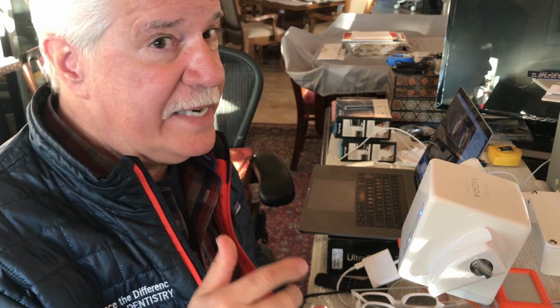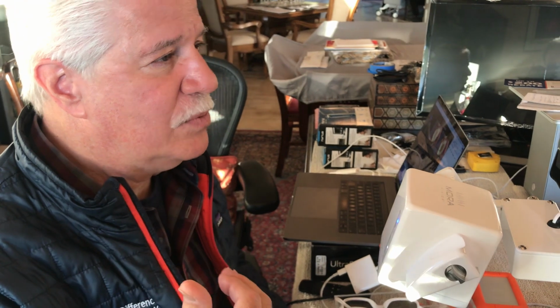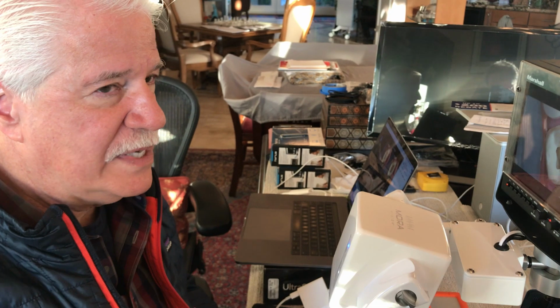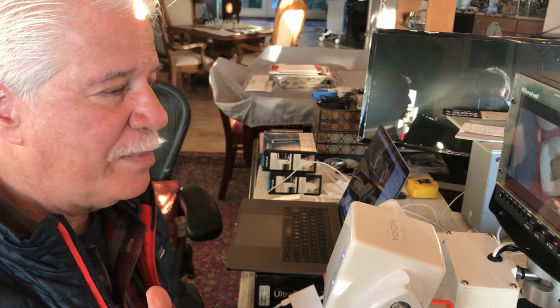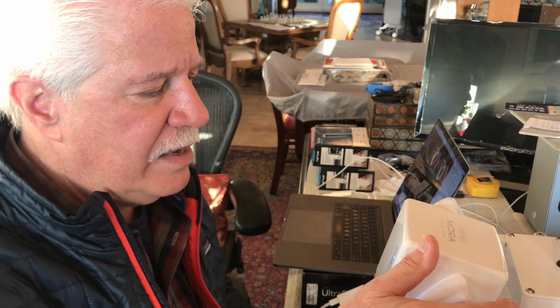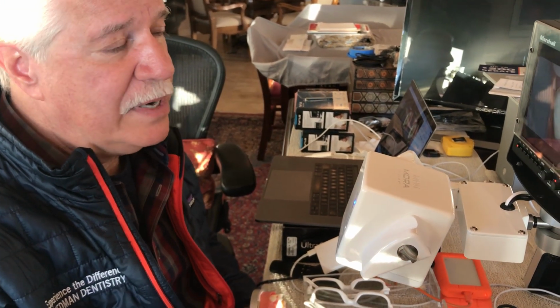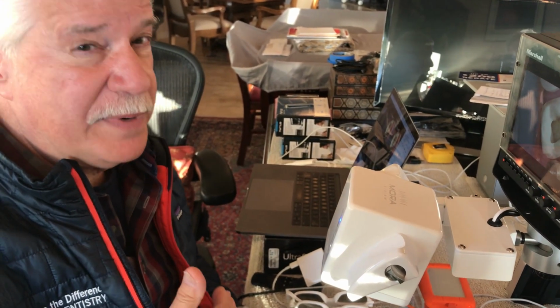Right. The reason is because even with inclinable binoculars, which is what we have on our 5 global microscopes, we can only incline those binoculars so much, and the optical path has to be somewhat straight from our eyes to the area of interest. The difference here is the ability to take the cameras and move them to an infinite positioning. It wouldn't be necessary for a patient to lay back. In fact, a patient could be at a 45-degree angle. They can almost be sitting straight up.